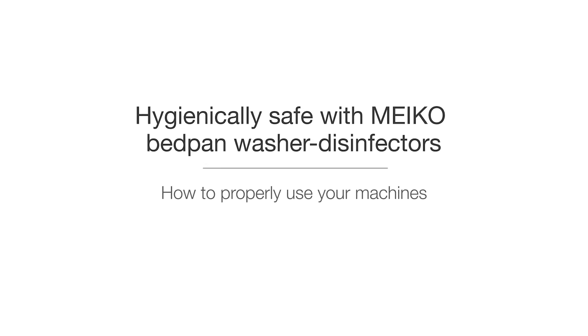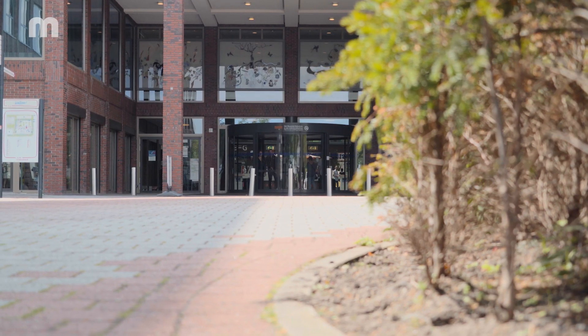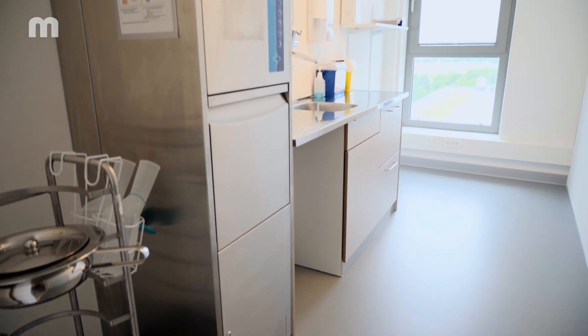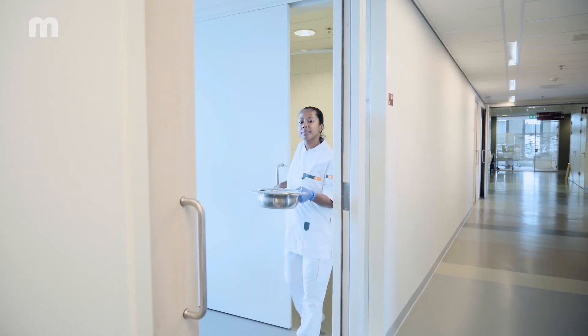You work with a bedpan washer disinfector from Myco with automatic door opening? In this video, we want to show you how to operate the appliance correctly. While doing so, always make sure to observe hygiene and clothing regulations that apply in your workplace.